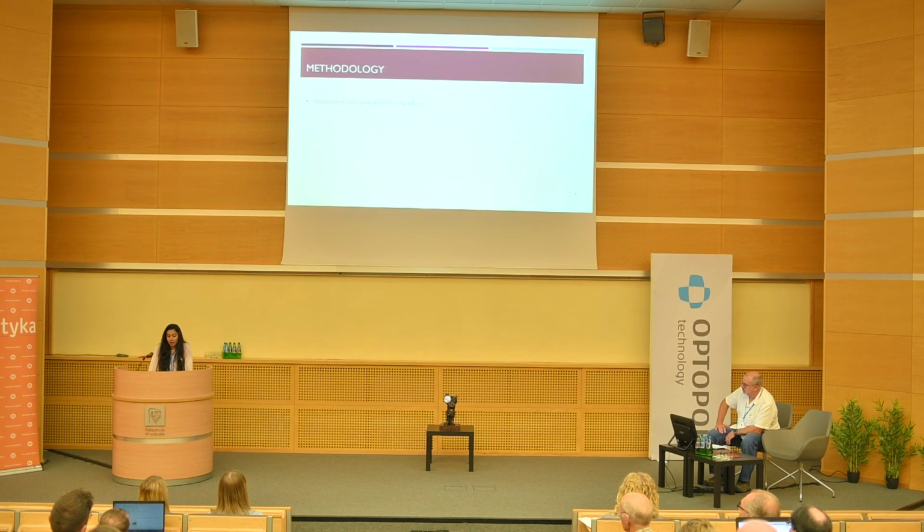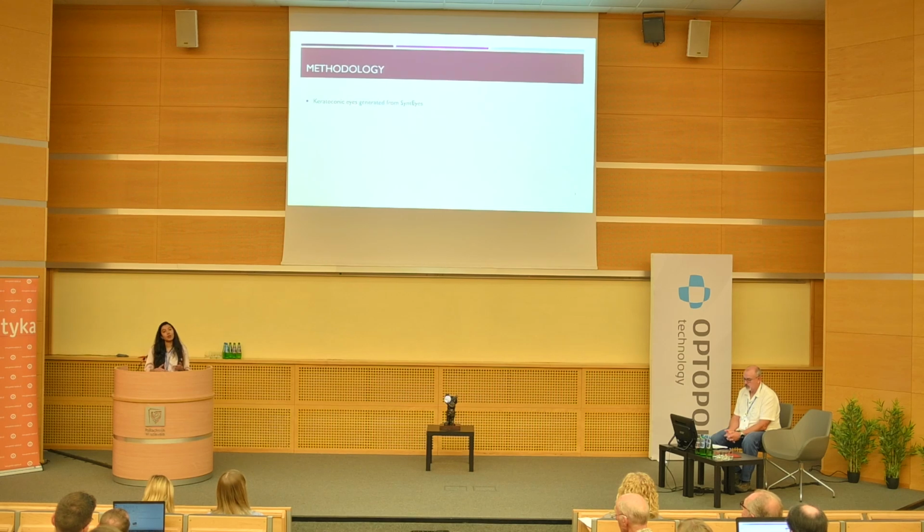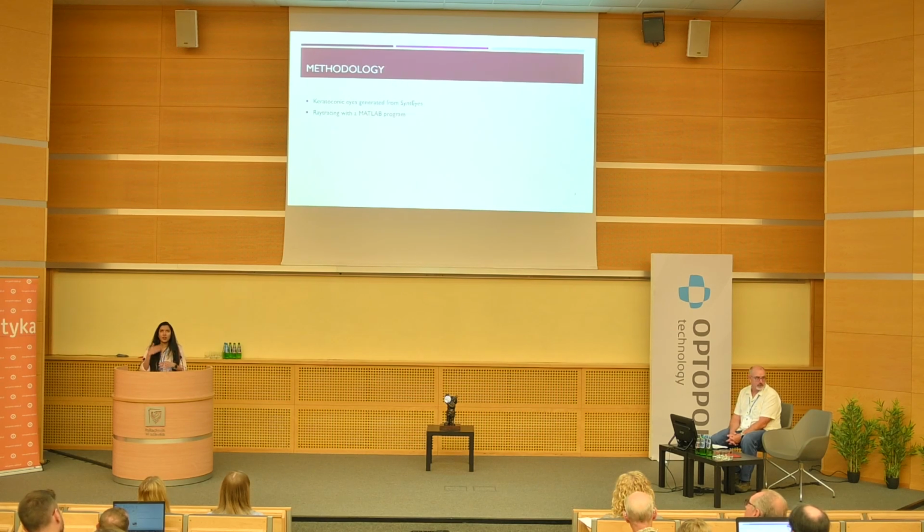For the methodology, first we need a set of eyes on which the study is done, and these eyes are generated by SyntEyes, a statistical eye model which gives very realistic biometrics of normal and keratoconic eyes, from which the eye is optically simulated. Then the eyes are ray traced through a MATLAB ray tracing program, where a parallel beam of light of 555 nanometer wavelength and 3 mm diameter is traced through the eye, and the resulting wavefront is analyzed.